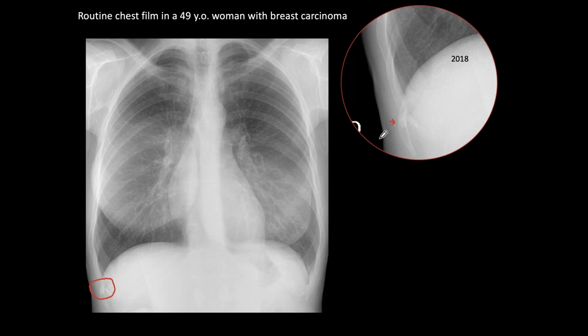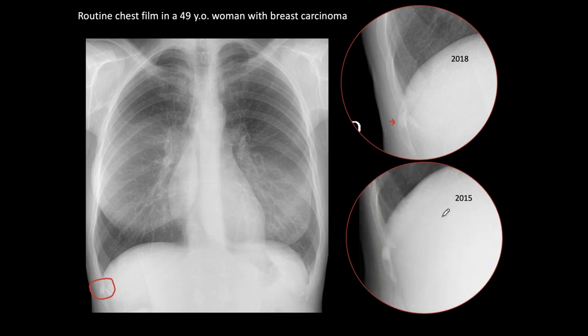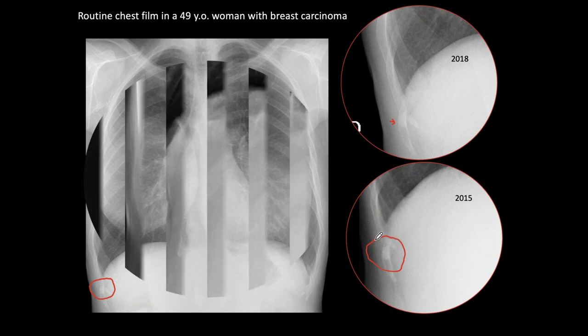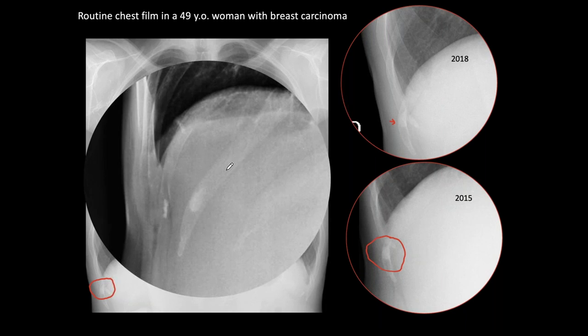This looks abnormal — it could be a metastatic lesion, especially from a carcinoma that gives sclerotic metastases. But when we look at the previous film from 2015, three years earlier, it hasn't changed. Just to be sure, we took an oblique rib view, and we see the typical appearance of the bone island. Therefore this is not a sclerotic metastasis — it is a non-significant finding.